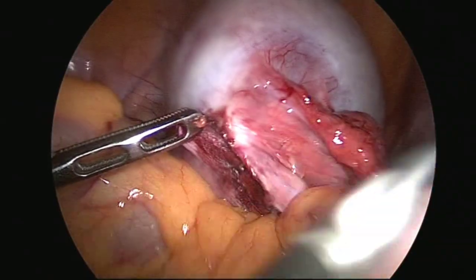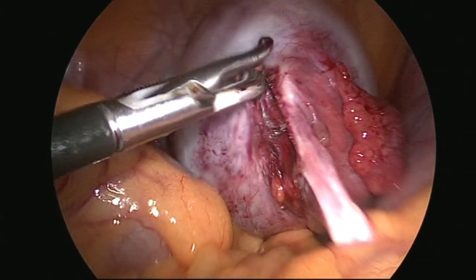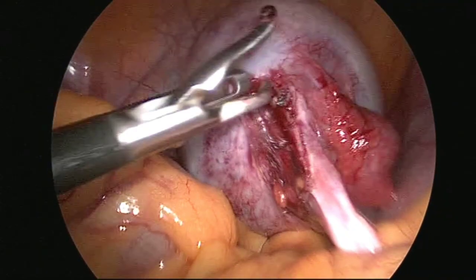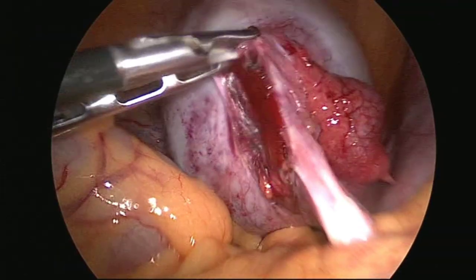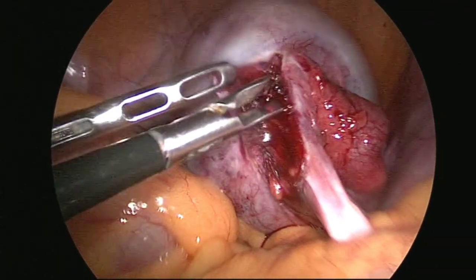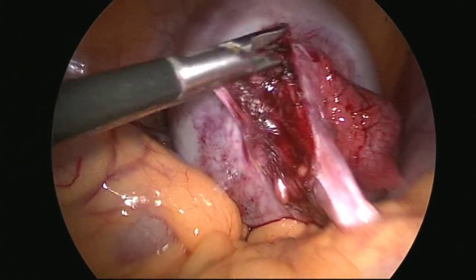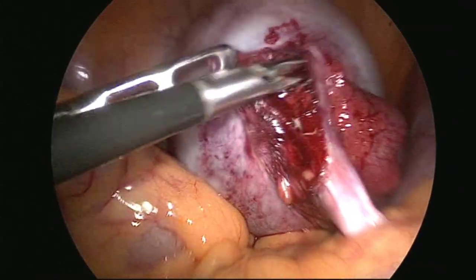Yes, this is the ovarian tissue and this is the fallopian tube. I am far from the fallopian tube. I am also trying to protect some ovarian tissue. Still I am unable to find the good plane, but hopefully I will find it.